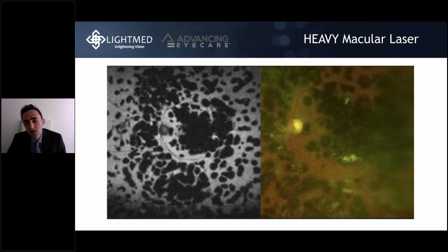In regards to the focal laser treatment for diabetic macular edema, I actually use pretty much the same protocol that I use. I test with the focal laser points close to the arcades, then switch to the SP mode 5% or 7.5%, make my way to the central part macula if necessary. And I've been using the pattern mode on the 561 as well, with no issues.